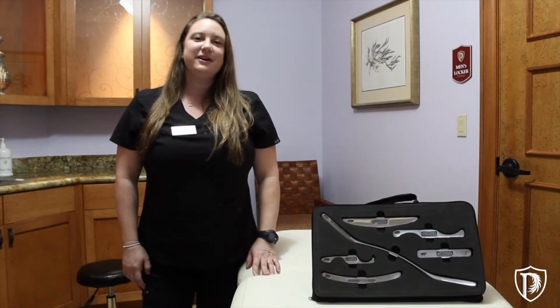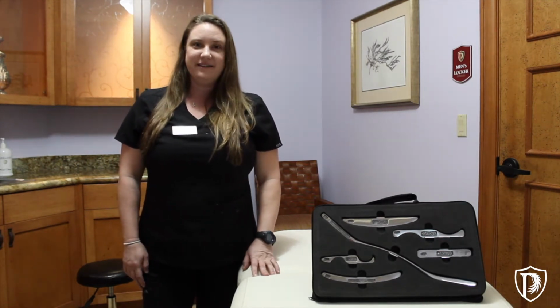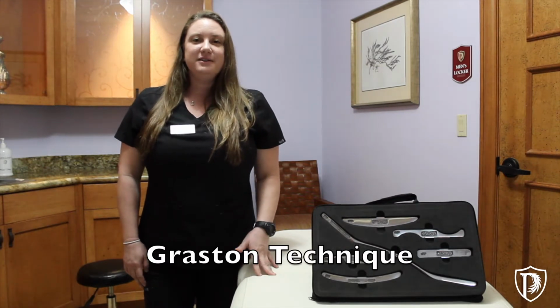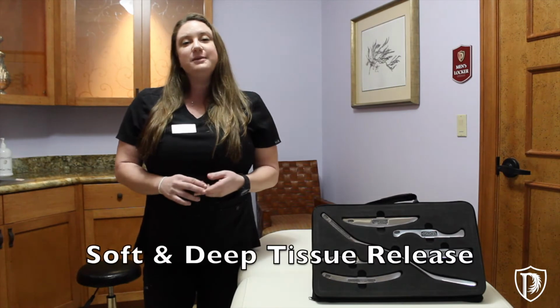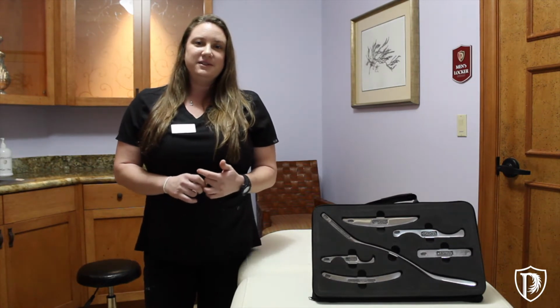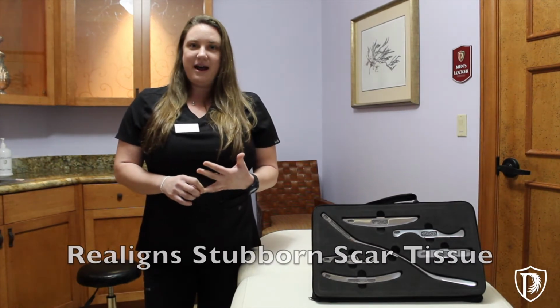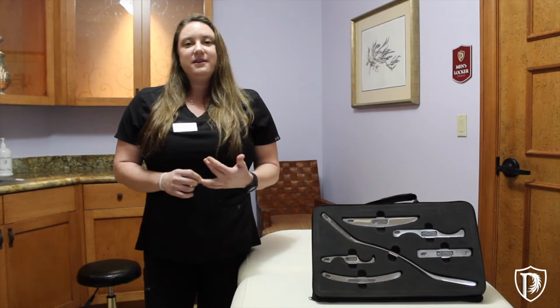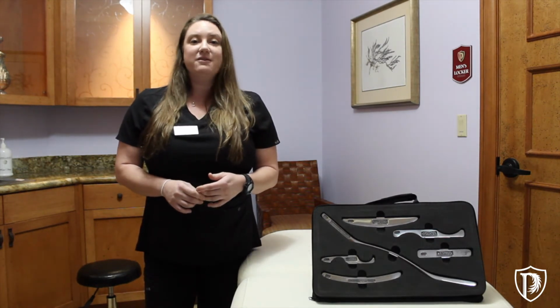And today I wanted to talk to you about one of the manual treatment therapies that I use called the Graston technique. So the Graston technique is basically the use of metal instruments for the purpose of soft and deep tissue release, as well as decreased tension in tight muscles. They also help to realign stubborn scar tissue that's laid down in your body after an injury, as well as increase blood flow and circulation to injured areas in order to promote healing.